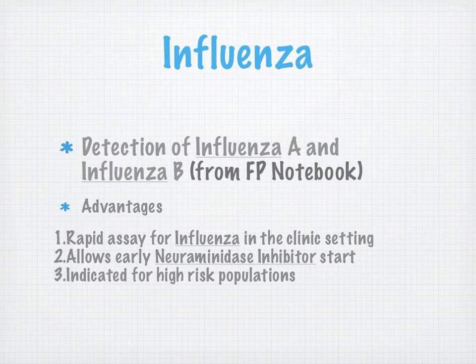All right, so influenza. Detection of influenza A and influenza B from Family Practice Notebook. So what are the advantages here? So number 1, we have a rapid assay for influenza in the clinic setting. And number 2, it allows early neuraminidase inhibitor starting. So you can start with the prophylactic. I guess it wouldn't be prophylactic. It would be the antivirals at that point.